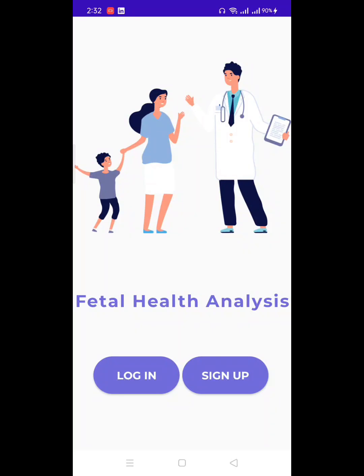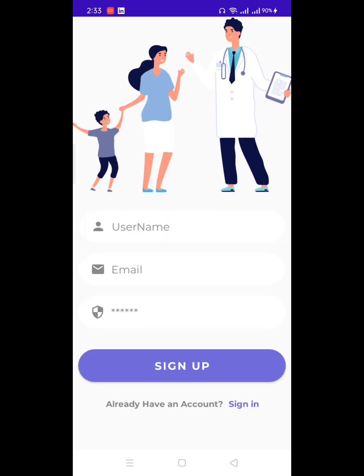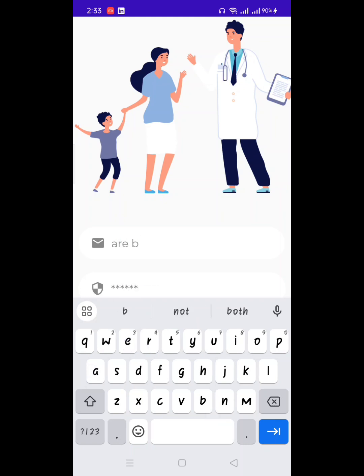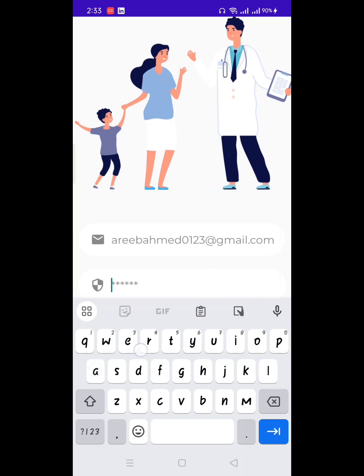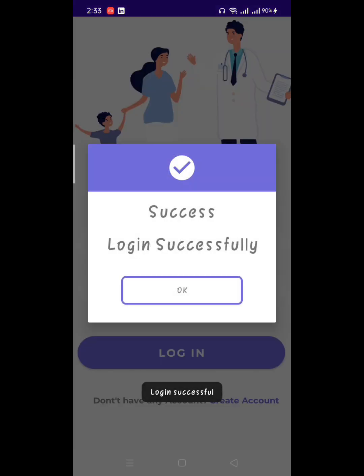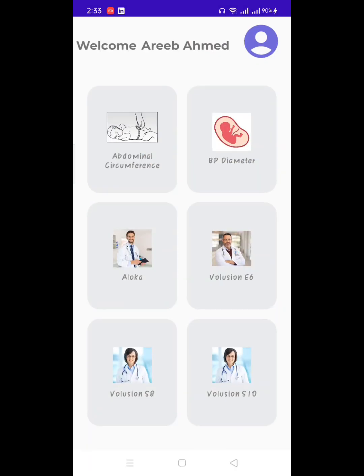So here is our mobile application. As I showed you, there are two main screens: login and sign up. First I'll show you sign up. This is sign up, from where you can sign in. If we have already signed in, then we'll directly go to the login. Here we enter our credentials, that is email and password. This is my email, and for password I'll write my password, and when I click on login, it shows me successful login. I click OK, and there are parameters.